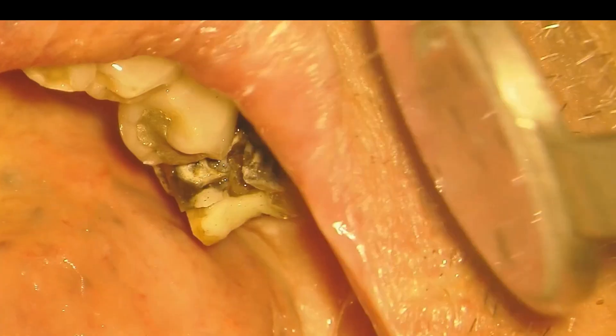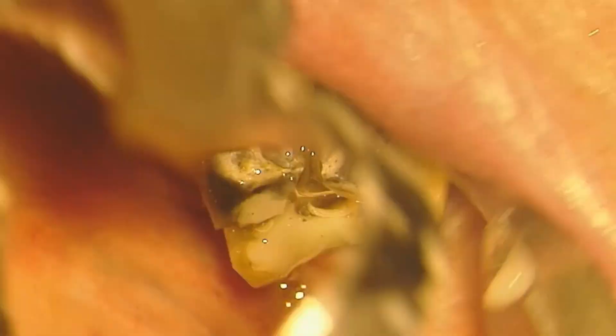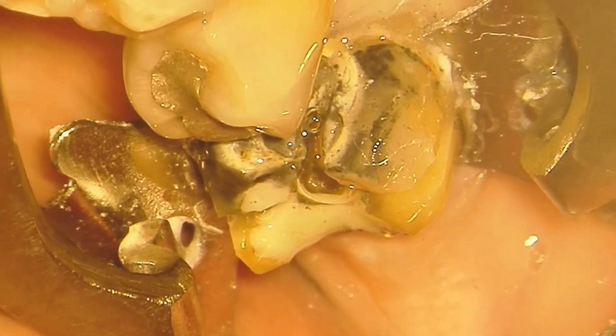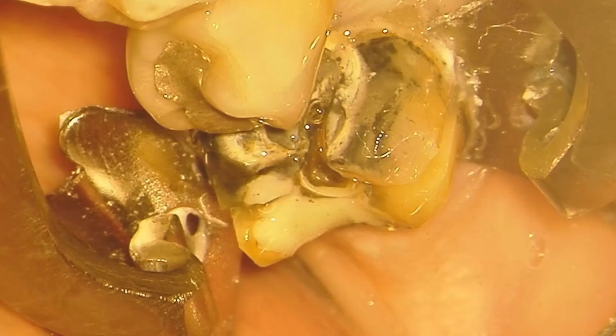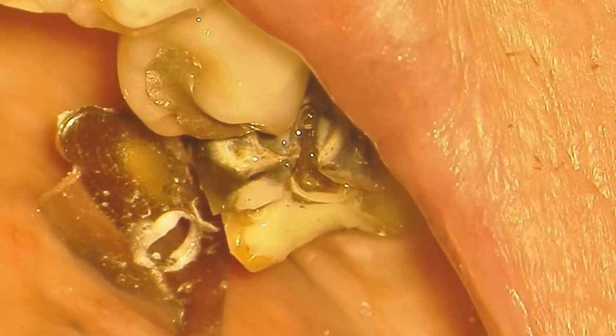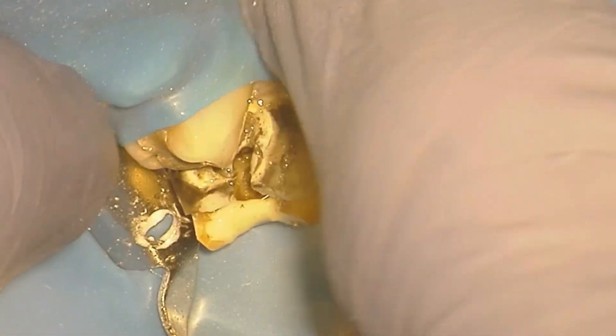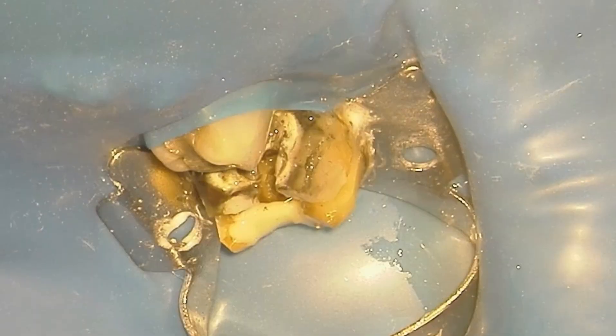You're going to see it here very briefly. There we have the tooth all prepared, ready to go. We're going to place that clamp — I like the 13A. The 13A clamp is great for the upper left and the lower right. We're going to take that handy dam with a figure eight in it, stretch it over the bow and then around the wings of the clamp, then stretch it over to tooth number 29.